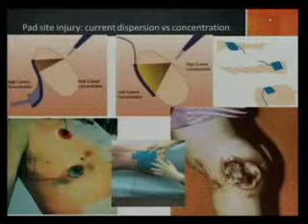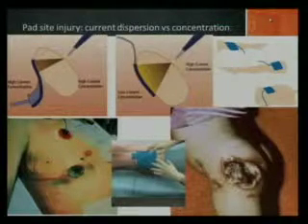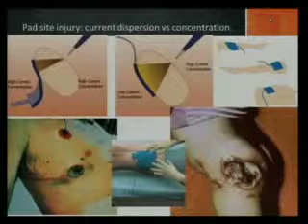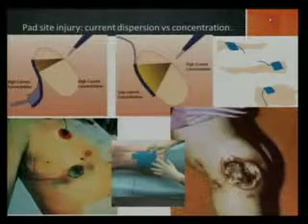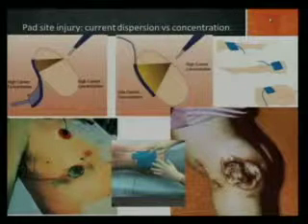I've never seen this, thankfully, but that's a good technological advancement that's been made as surgeons recognized flaws and weaknesses in electrosurgery.